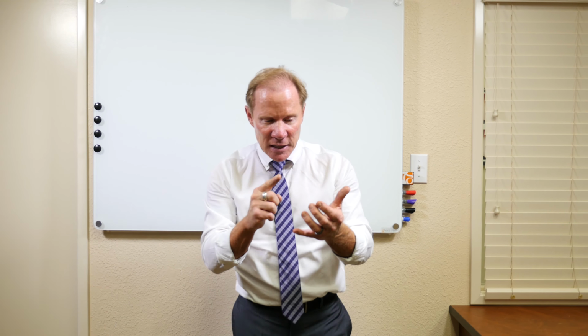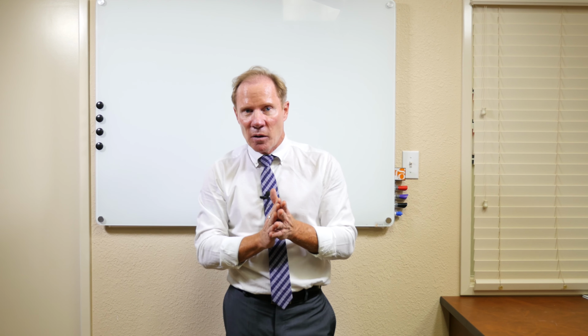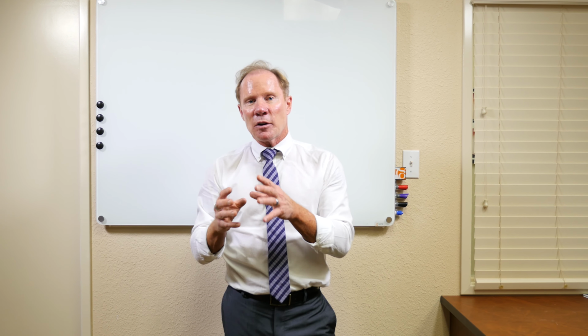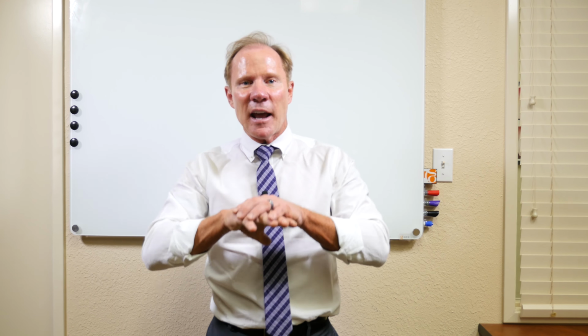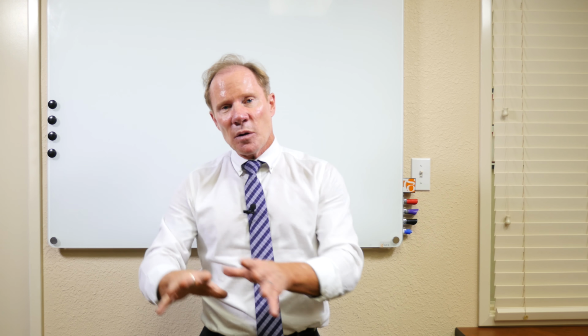Where we use TheraCal LC is direct pulp caps. It's awesome for that. Once we control the bleeding, assuming that it's not necrotic, we put a very thin layer of TheraCal. Typically, we like to keep our increments to 1 millimeter or less in thickness. It has a photo initiator in it, so we light cure it and it sets hard. Then we can move right on to our restorative.